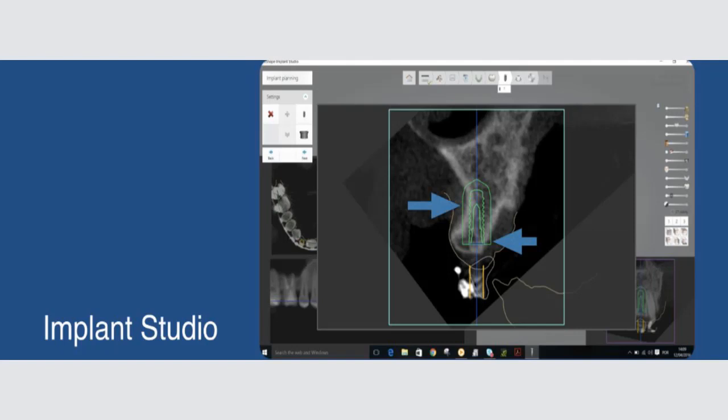Nowadays, I'm working mostly on 10 to 11 and a half implant length. I'm not going more than that. I don't see need unless it's really something out of the chart. But most of the cases I'm doing with 10 to 11 and a half implant length. That's pretty much my norm now. Anyway, so you can go, and this is a fenestration.